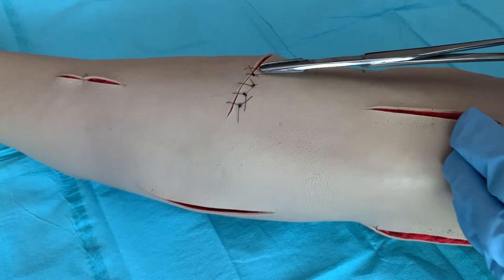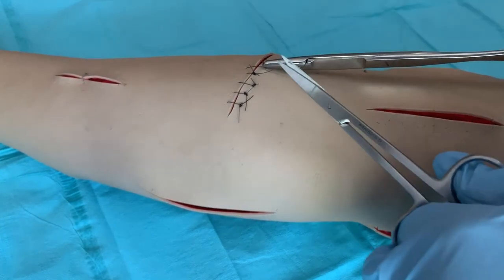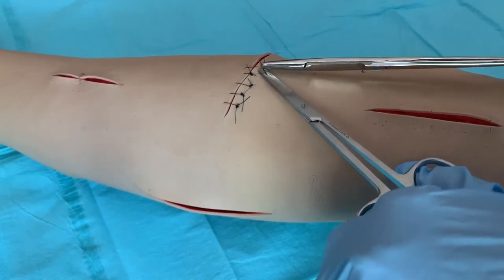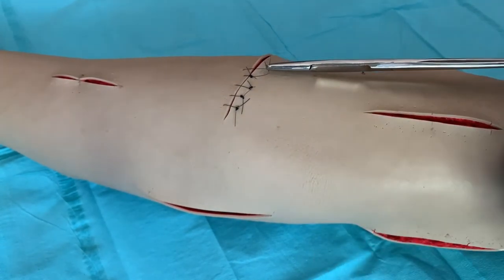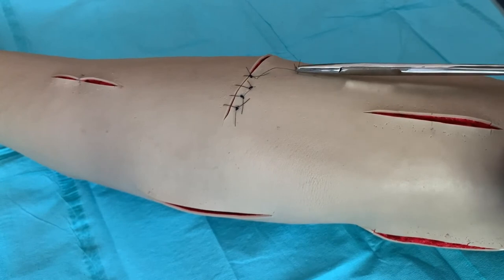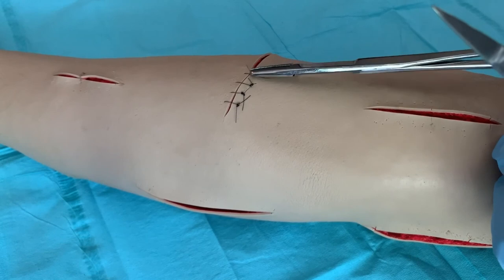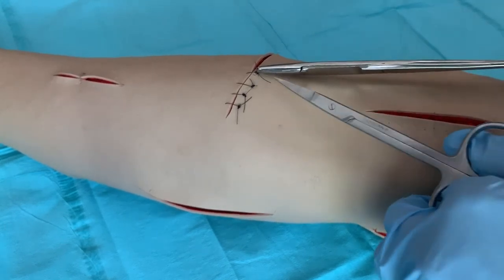Grasp the knot of the suture material with thumb forceps and gently but firmly pull up, making sure there is enough space to place the suture removal scissors to clip the suture as close to the skin as possible. Pull the suture with the forceps back toward the healing incision so that no stress is put on it.